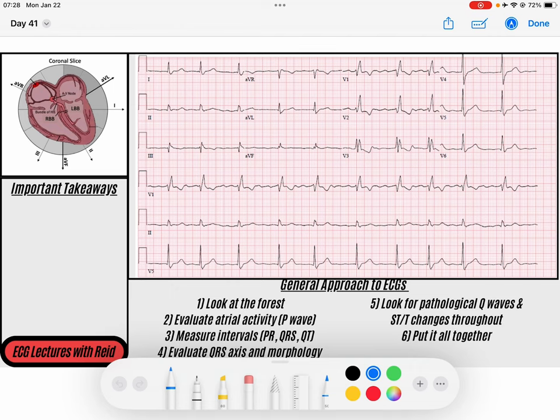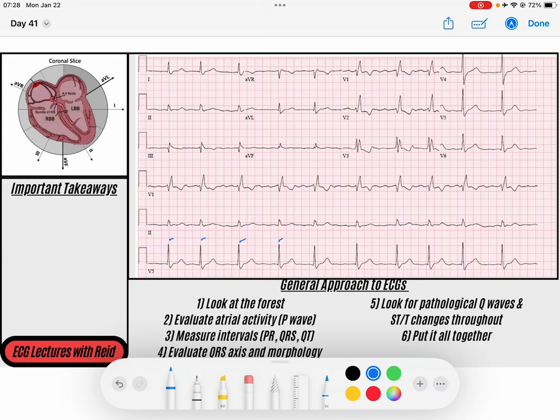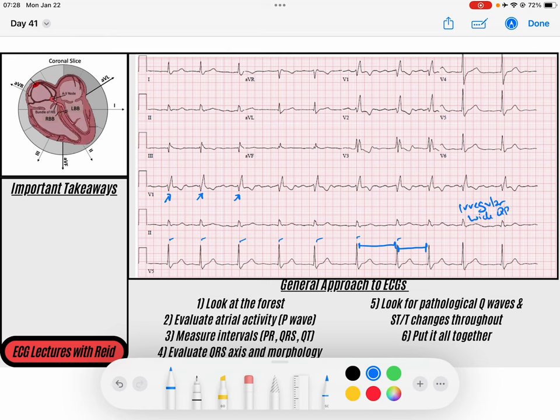The first thing I like to do is look at the forest and the trees. The forest is my QRS complexes. I like to take away my QRS complexes and see — I've got a somewhat irregular rhythm. If you look at some of these R-to-R intervals, some of these are longer than others. My QRS, looking through some of my leads, seems to be a bit wide — we'll measure that in a little bit. So I would say I've got an irregular rhythm with a wide QRS.